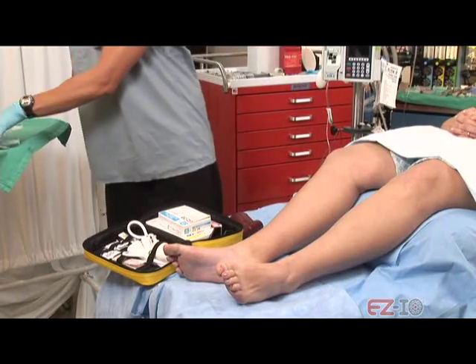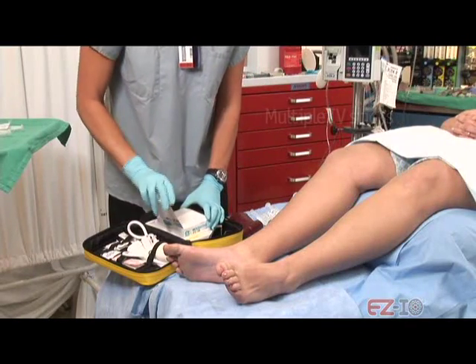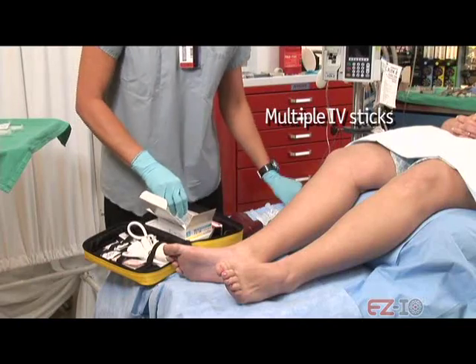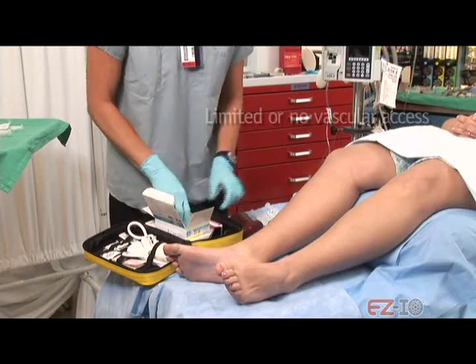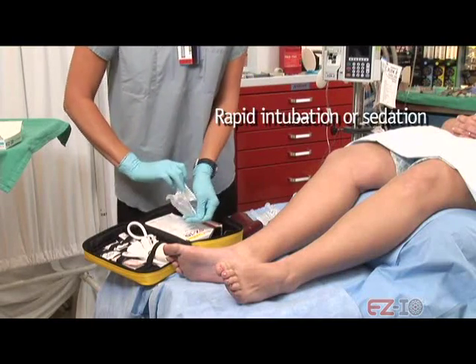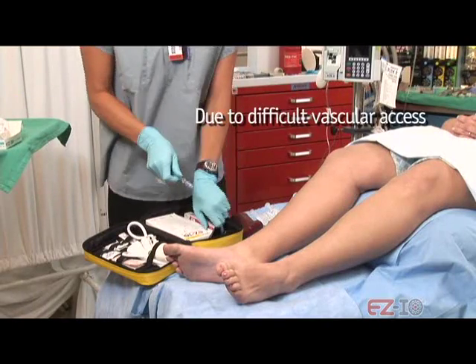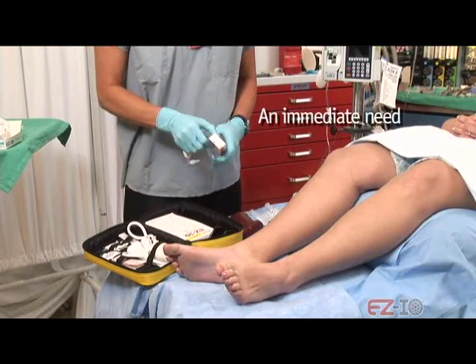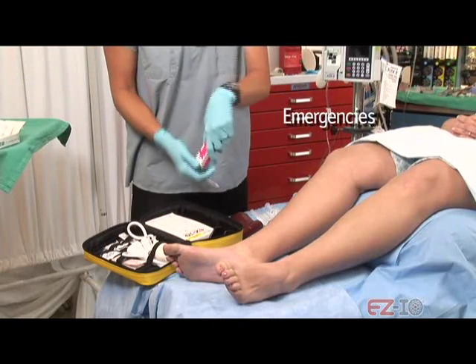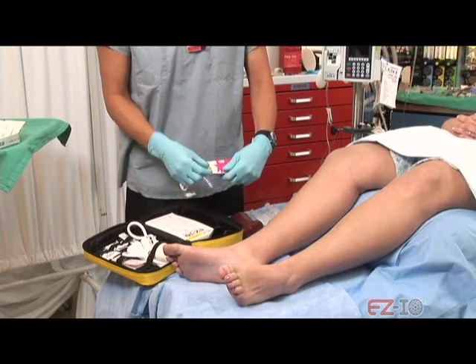I.O. is indicated for acute patients who are experiencing cardiac or respiratory arrest, require multiple IV sticks to obtain vascular access for medication or fluid infusion, have limited or no vascular access, require rapid intubation or sedation, previously have required central venous access for infusion due to difficult vascular access, have an immediate need for drugs or fluids, or require intraosseous access for emergencies.